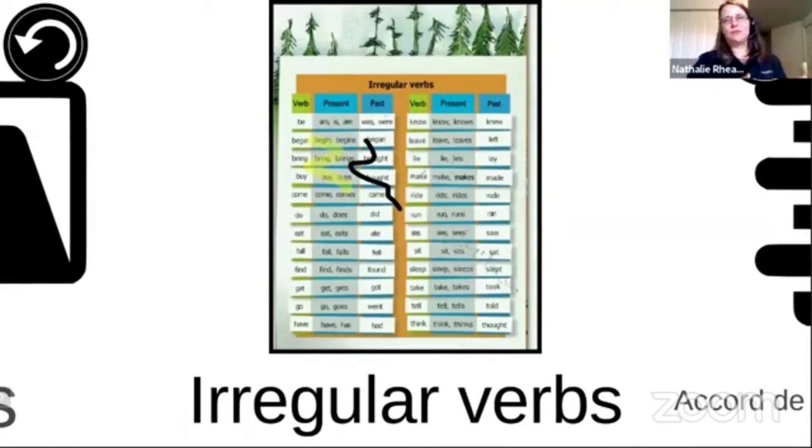So it's easier to do. You don't have to go into Android. You save time, and students with less experience with Android or younger students can do it by themselves. So this is one way of importing and exporting PDFs through a USB. That was a request that was asked several times, so that's why we decided to show it this way.